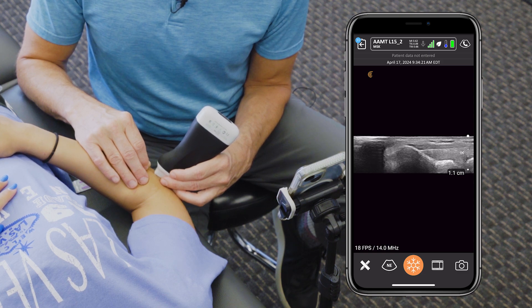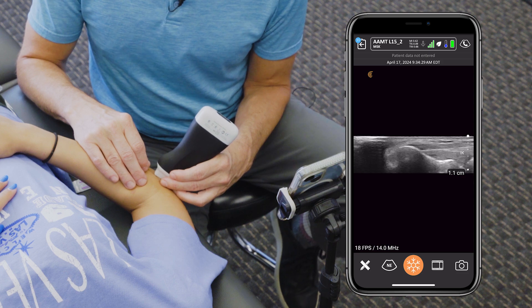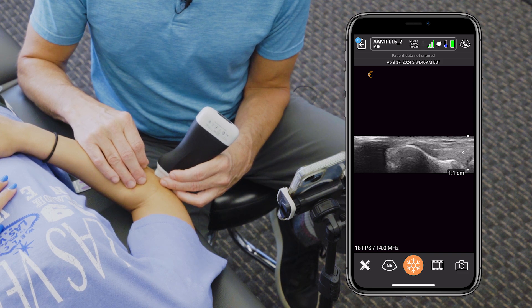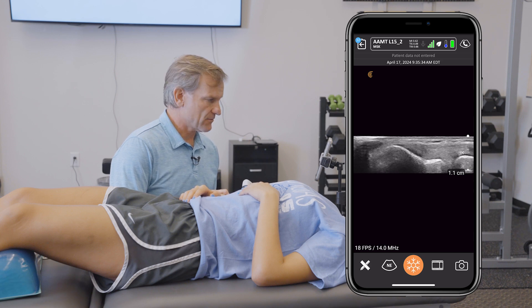Once we're there, if the patient has longstanding chronic tendinosis, we're probably going to do a little pecking on the periosteum to create some influx of new healing. We'll stay there and peck for a few seconds and then pull the needle out. That is the ultrasound guided dry needling procedure for the lateral elbow and the common extensor origin.